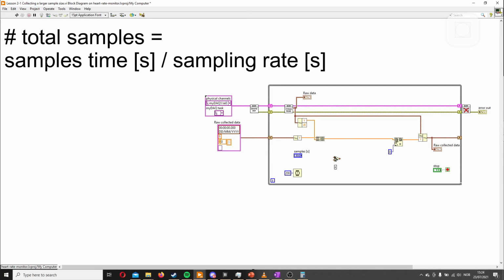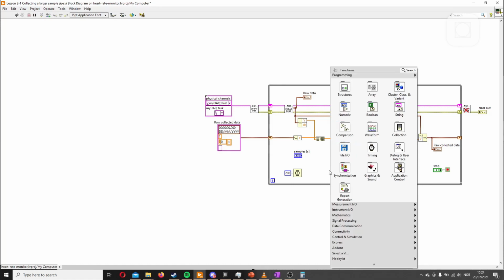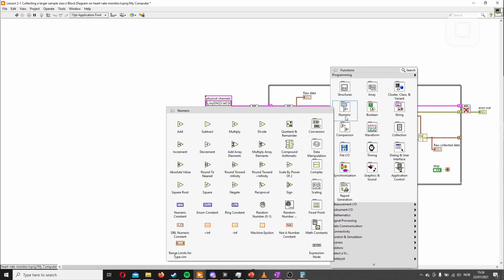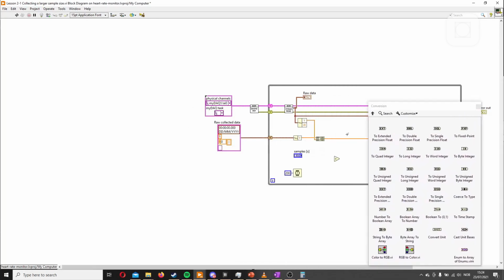So this one just takes in doubles. So what you can do is to get these conversion palettes. You don't need them, so I could connect this one directly to this one, and the red dot means you convert it. But I prefer to just change it here, because the red dots can indicate that sometimes it doesn't work, but LabVIEW does this automatically. But it's good to know, so you have more control.